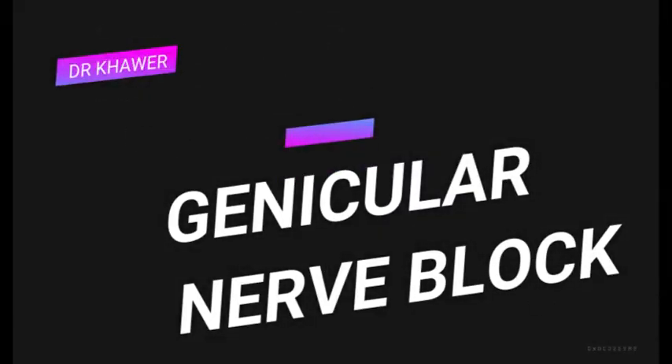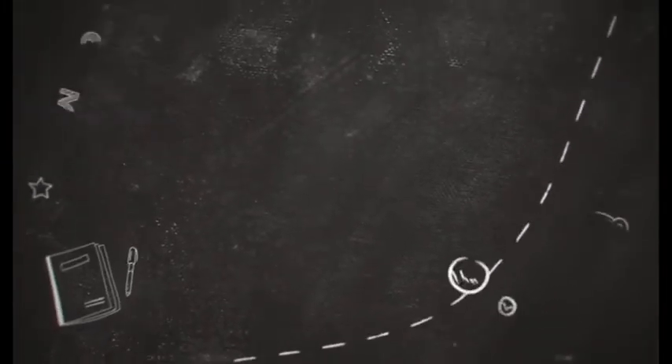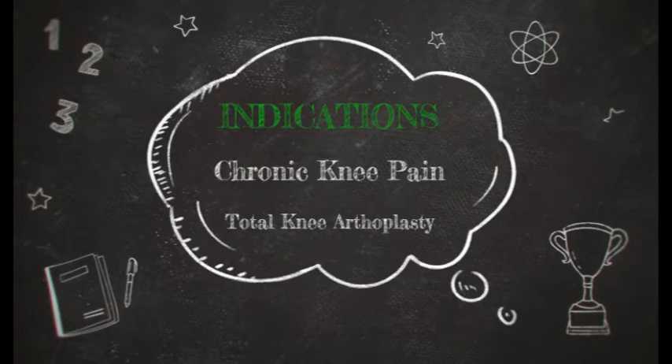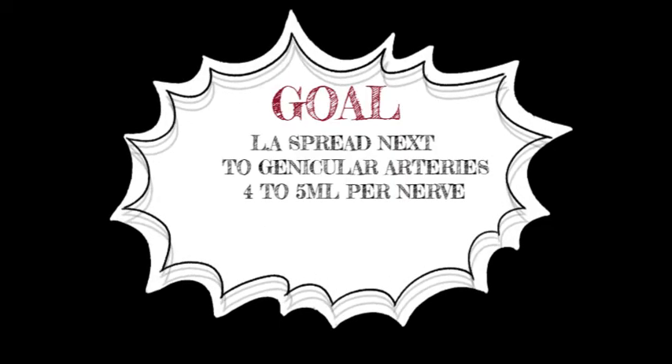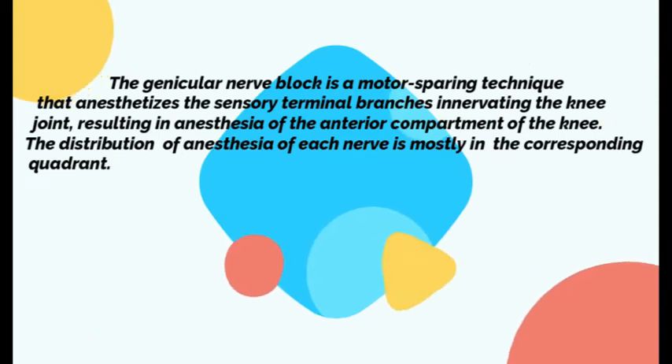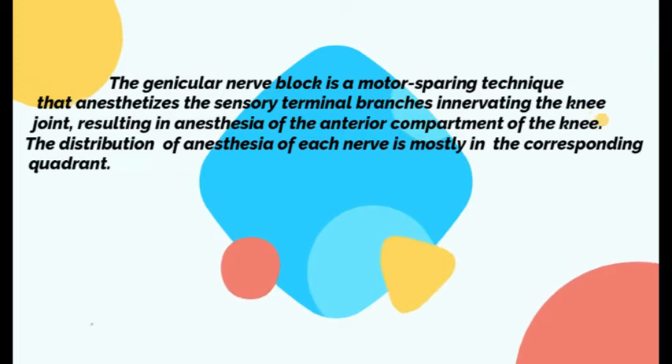Ultrasound-guided genicular nerve block. The main indications are chronic knee pain and total knee arthroplasty. Our goal is to inject four to five ml of local anesthetic around each nerve. This is a motor-sparing technique where we anesthetize the sensory terminal branches innervating the knee joint.